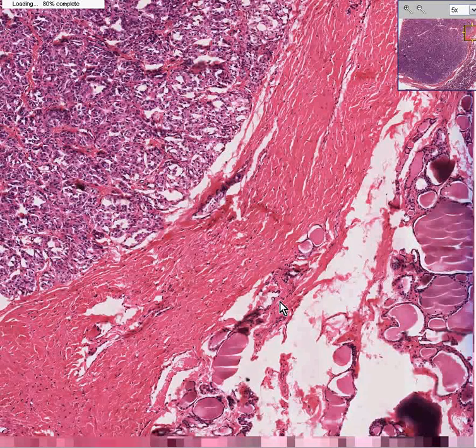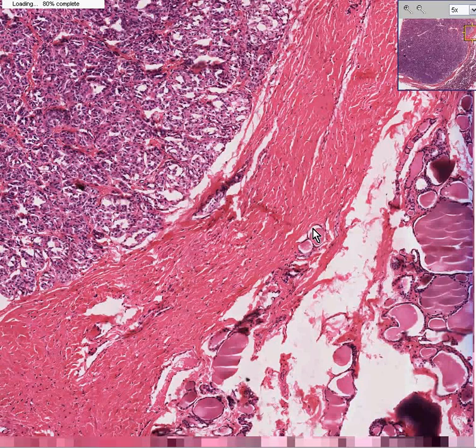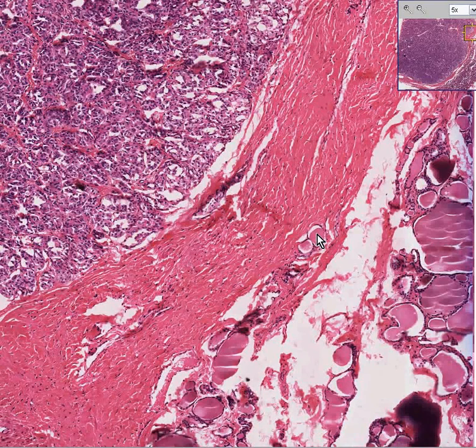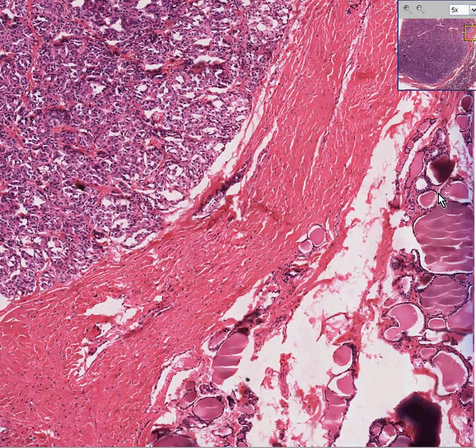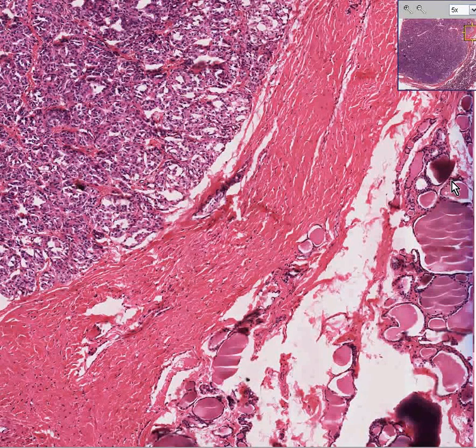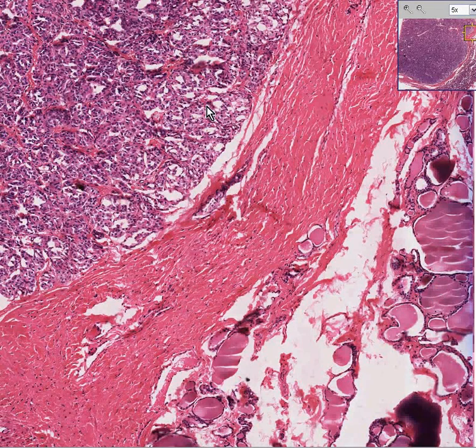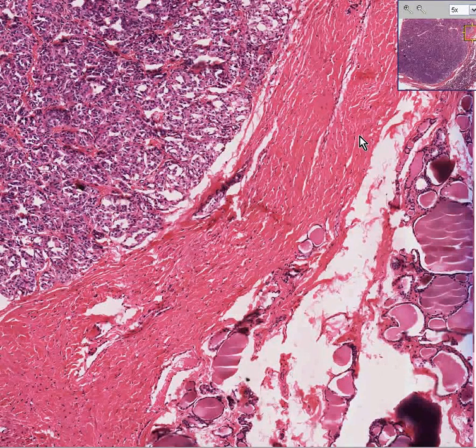Now you might be thinking that some of these follicles probably invaded the capsule, so that means this is cancer. Look very closely — these little trapped follicles out here have no semblance at all to these micro follicular structures of the tumor. These represent either traps or fibrosis around the normal thyroid follicles on the other side. If, however, you saw tissue like this very clearly going through or well into this capsule, then you could start to get worried.